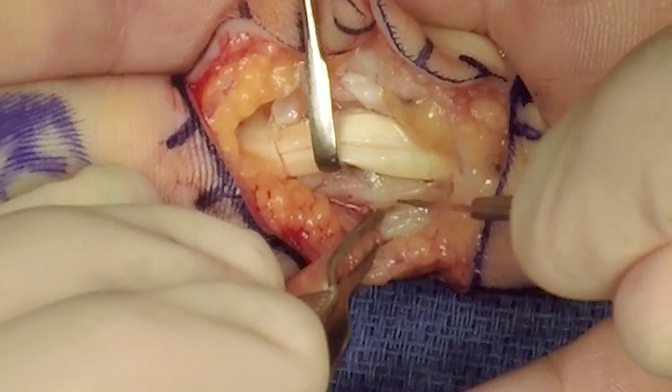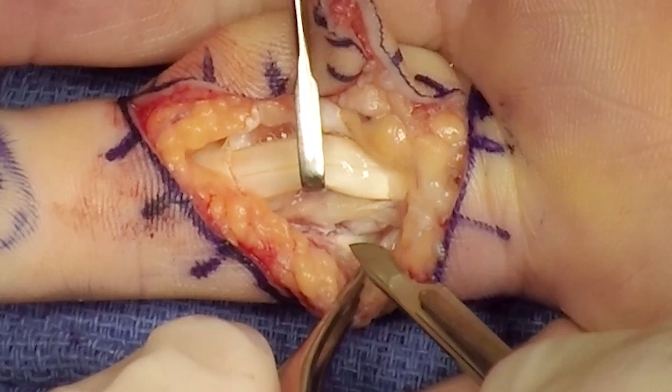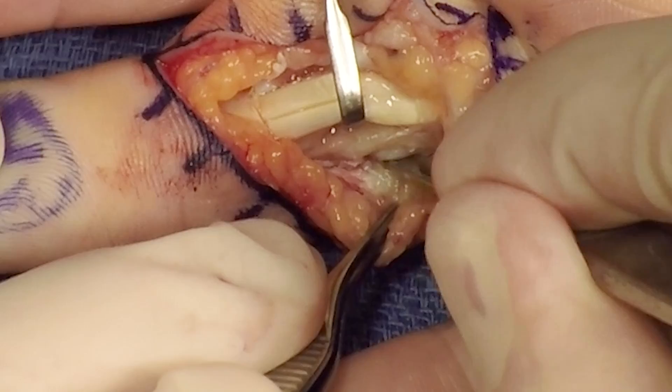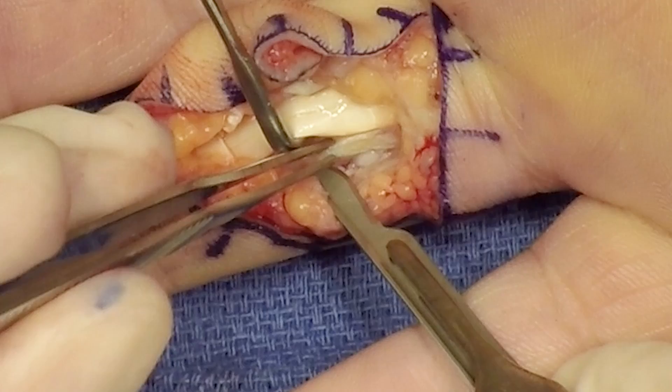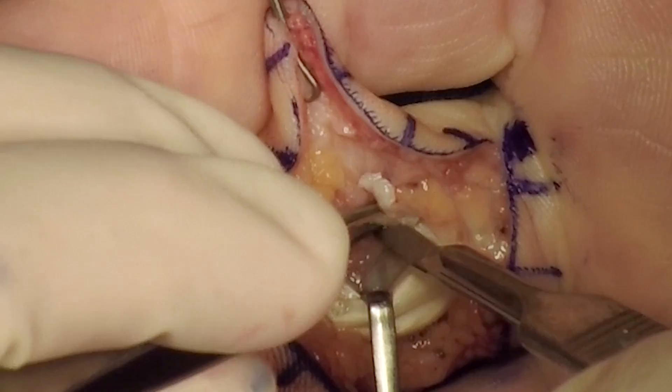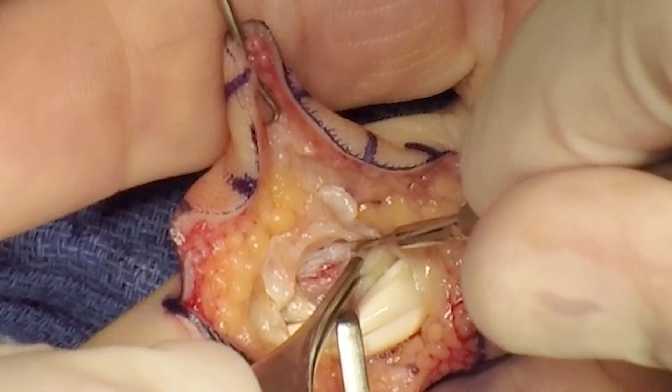The joint is entered between the accessory collateral and the volar plate. The collateral ligaments are released off the proximal phalanx. The volar plate is then released distally off of the insertion on the middle phalanx. Releasing of the collateral ligaments as well as the volar plate is then performed on the radial aspect of the joint.